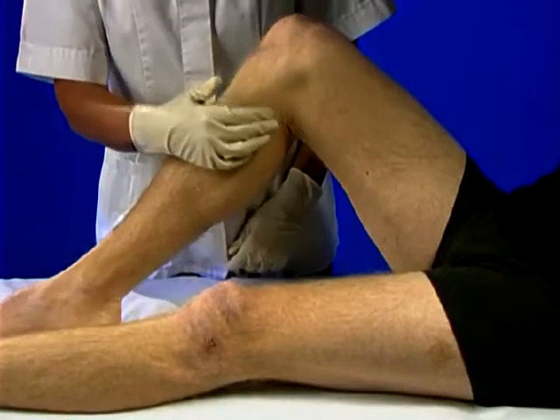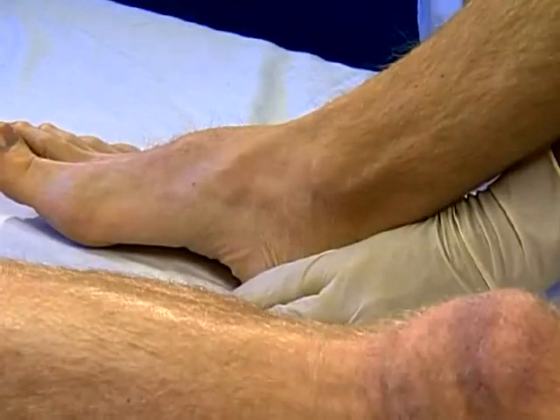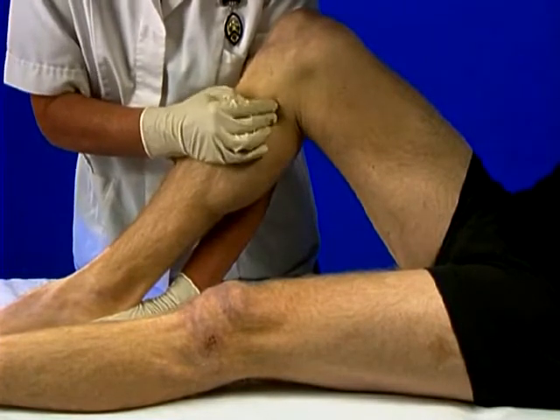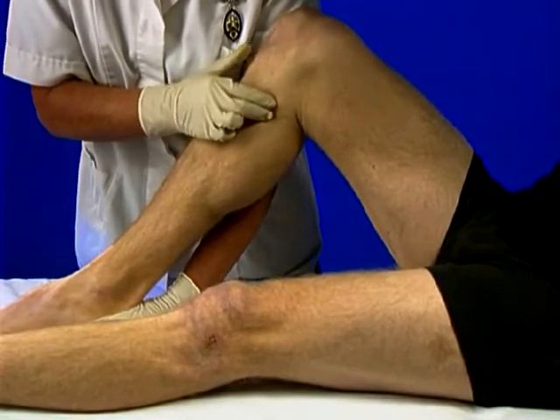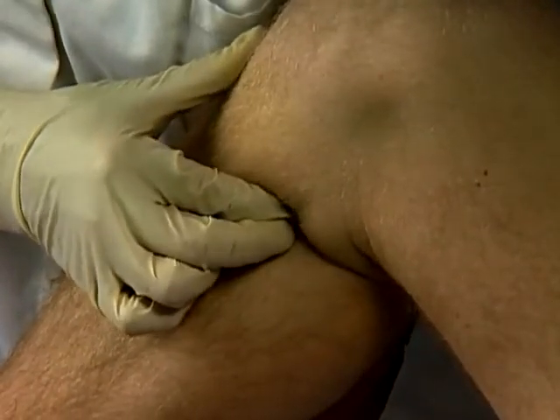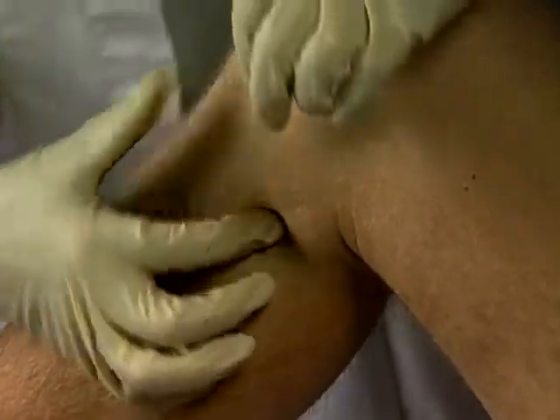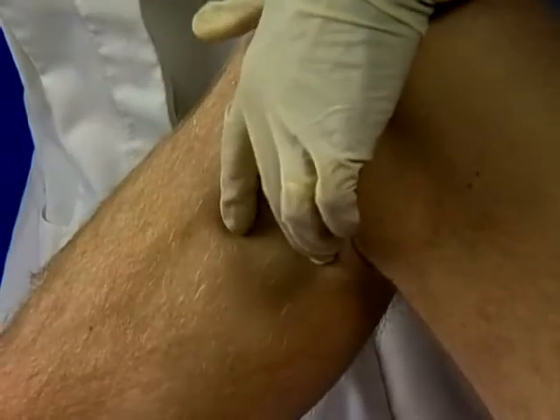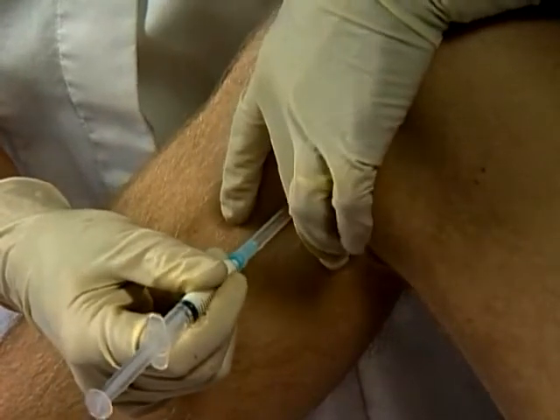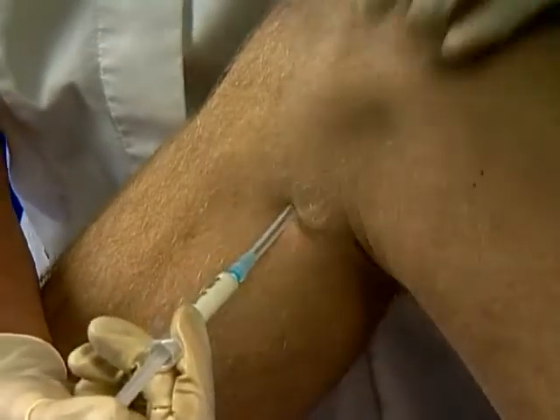The bursa lies on the medial side of the knee and is identified by resisting knee flexion strongly while palpating the 3 medial hamstring tendons until they disappear on the edge of the tibia to form the pes anserinus. Immediately proximal and deep to this is the tender area of the bursa. Mark entry point here, clean and firmly stretch the skin, and rapidly insert needle perpendicularly. Pass slowly down to gently touch bone. Withdraw slightly, aspirate, and inject as a bolus.